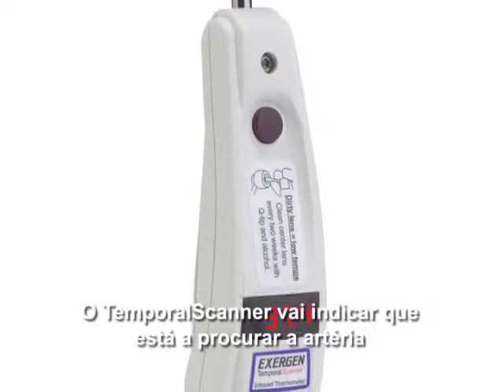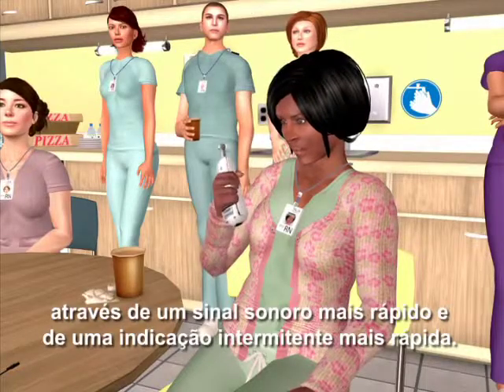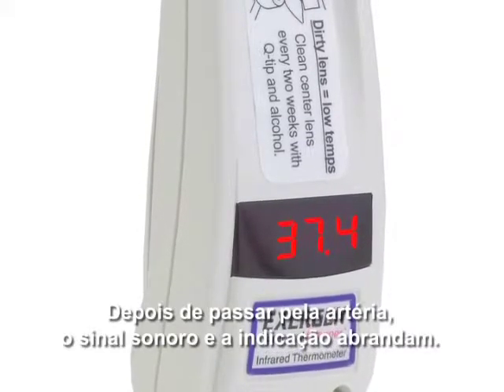The temporal scanner will indicate that you're scanning over the artery by faster beeping and faster flushing display. After you pass the artery, the beeping and the display slow down.